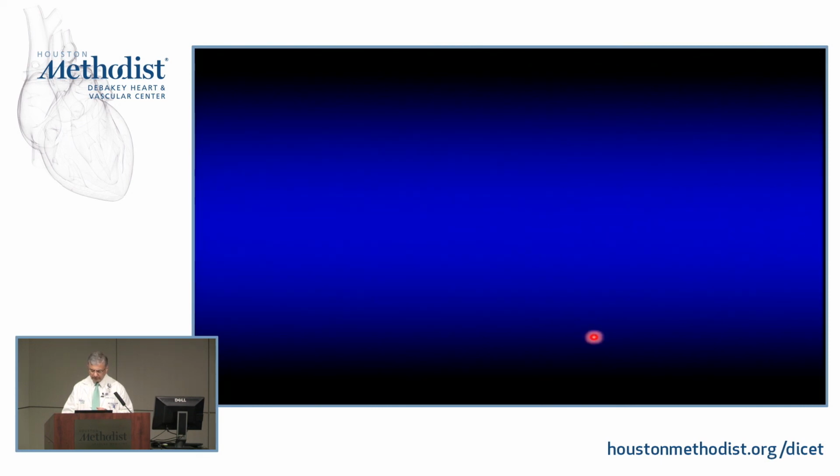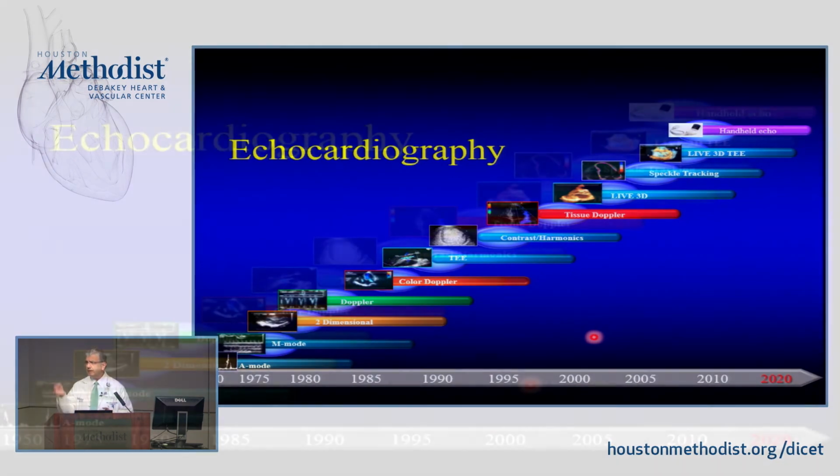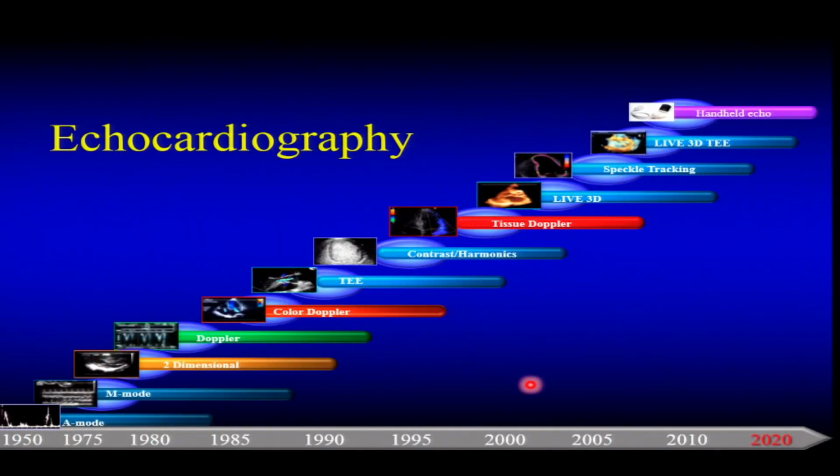If you take a look, the field is amazing. Still the same premise has not changed. Ultrasound, waves, packets, the crystals have not changed much. Yes, the engineering of transducers, the technology of transducers, how you fire a transducer, the electronics of it, yes, but the principle is the same.